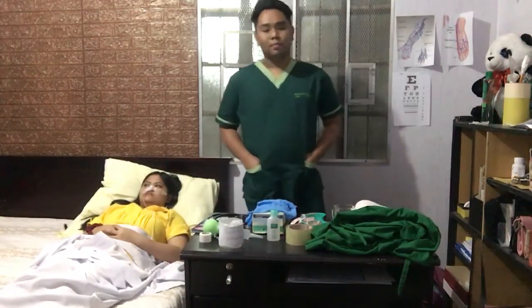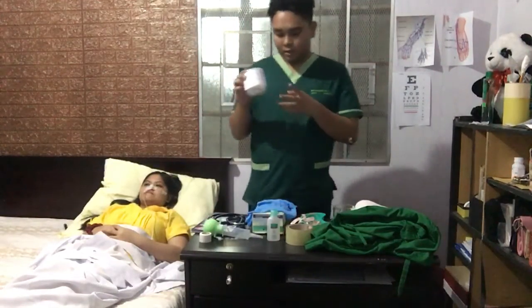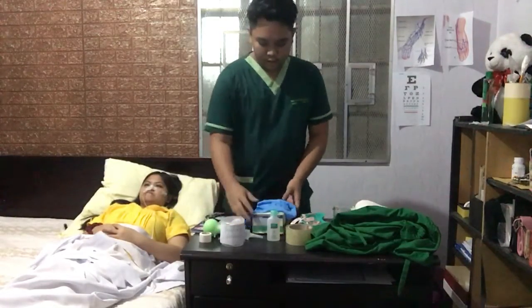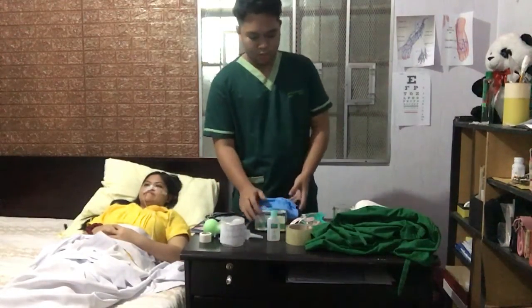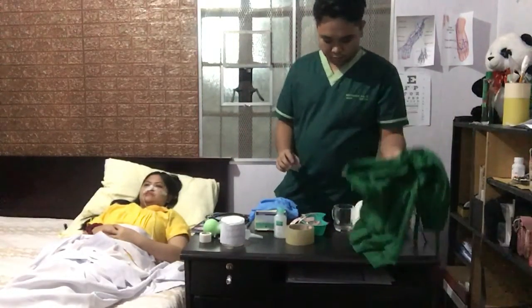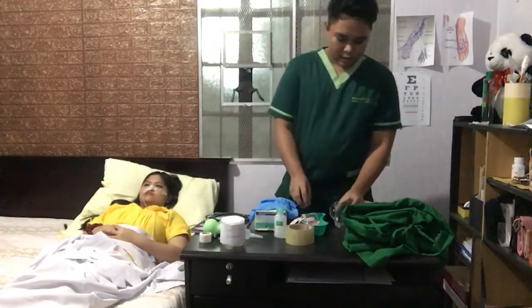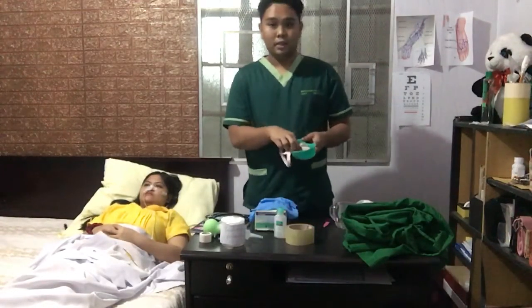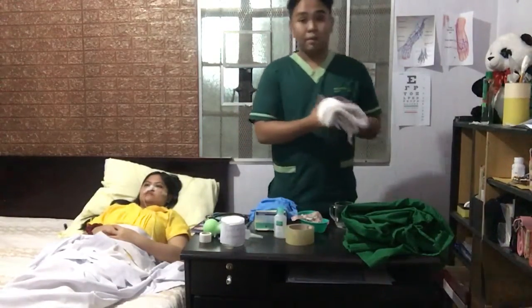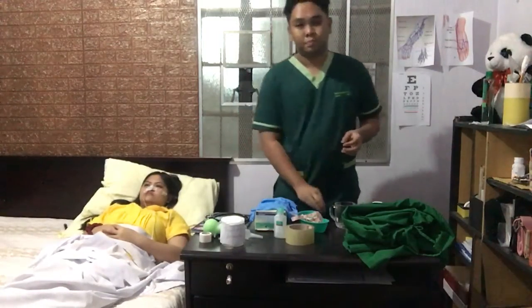So, for the equipment po, we need to prepare po yung prescribed feeding formula po. Then, stethoscope, non-sterile gloves po, alcohol preps, PPE, then water for irrigation po, then emesis basin, tape measure, then towel po, and then pH paper.